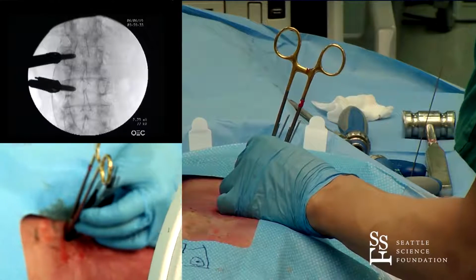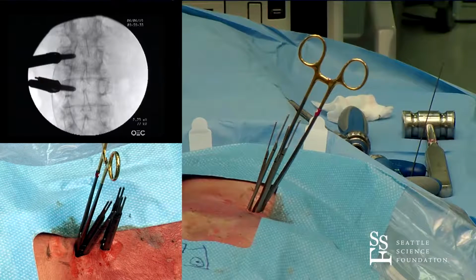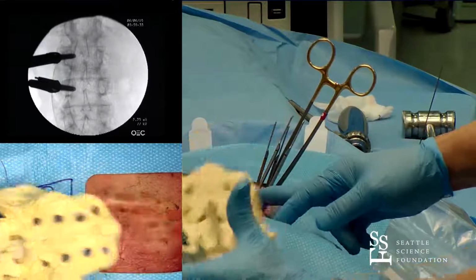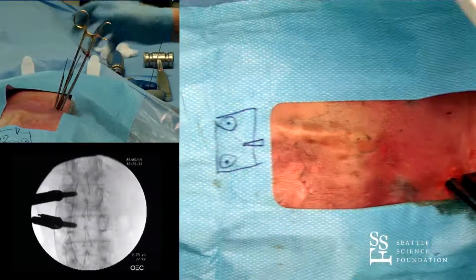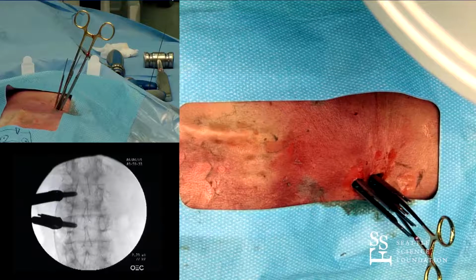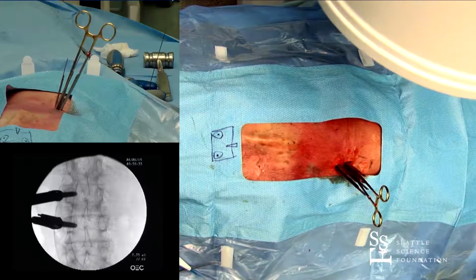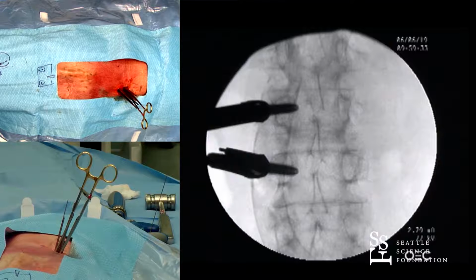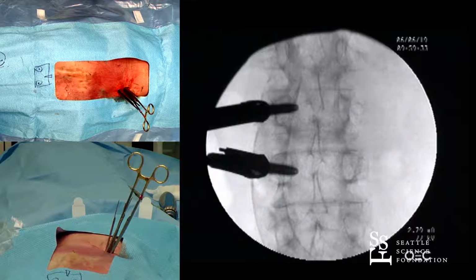Now, this is going to be a long rod. Can I see a cap screw? Oh, no cap screws. Oh, okay. Well, the next step is we would put these cap screws on, okay, and we're able to do them right through these tabs, all right, and then we would fashion the rod into place. Hopefully the rod is deep enough. The cap screw would actually help us drive the rod down into the base of the screw. We'll take a lateral right now and just show you the construct. Now, this is what you see on the top. We can take these slits.